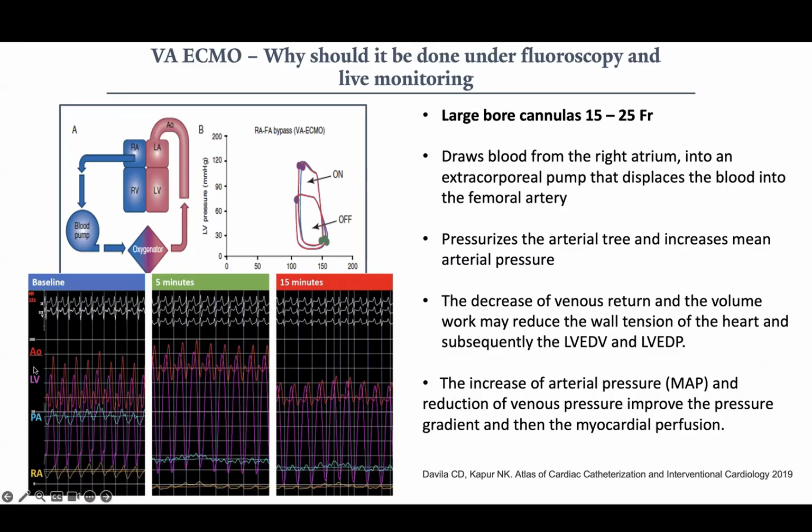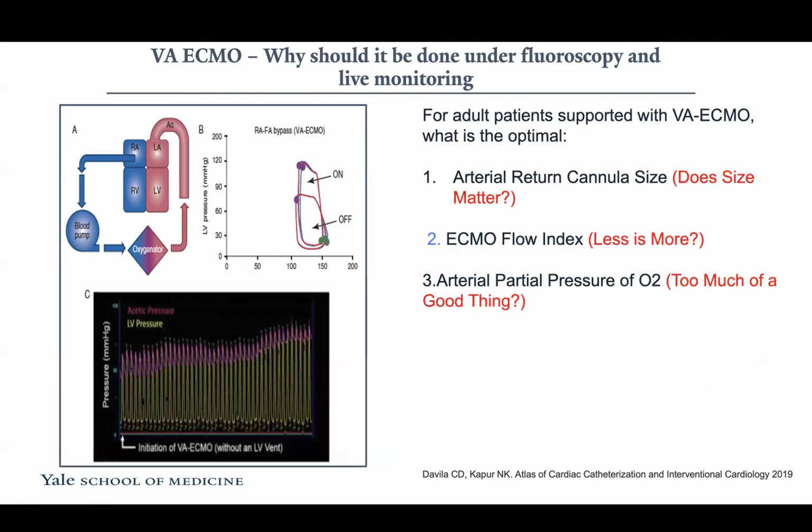So now that you're pumping blood against the heart, this PV loop is being translated into your LVEDP. So now you're raising LVEDP, therefore LA pressure, therefore wedge pressure, therefore output and index and whatnot. And that's where the concept of venting comes in, which we'll talk a little bit about.